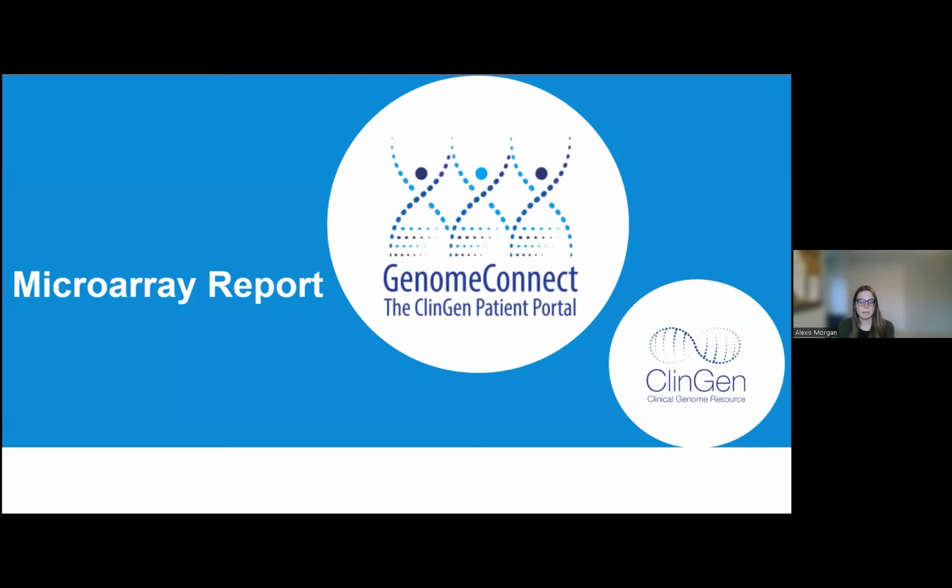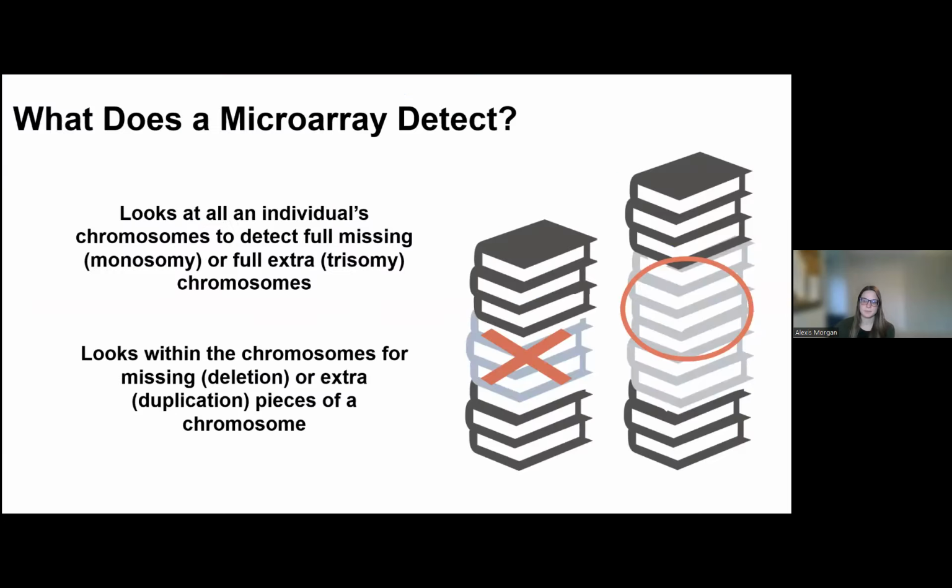So now that we have reviewed some genetic concepts, we're going to review some genetic test report examples. First, we are going to start with a microarray report. This specific genetic test, again, looks at an individual's chromosomes. It's able to detect full missing or full extra chromosomes, which are called monosomy and trisomy, respectively.